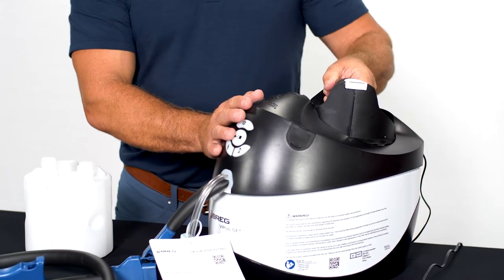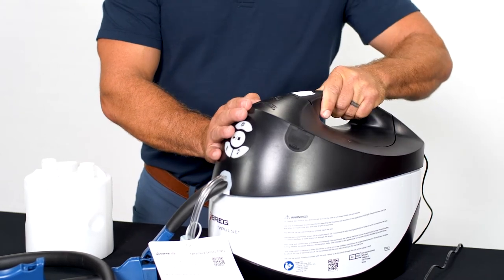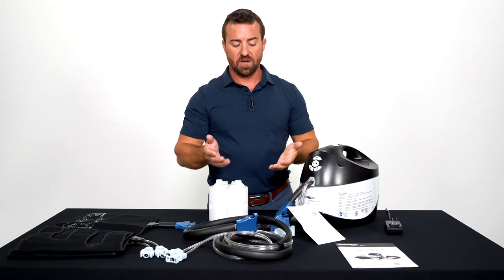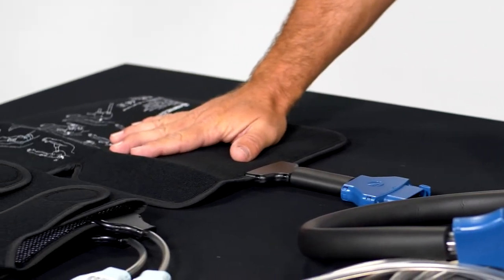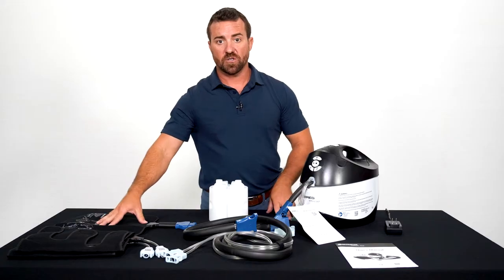Replace the top and turn until you hear a click. Once you're in place and ready to begin, place the calf wraps onto your calf and place the cold compression wrap onto your knee, shoulder, low back, or other surgery site.